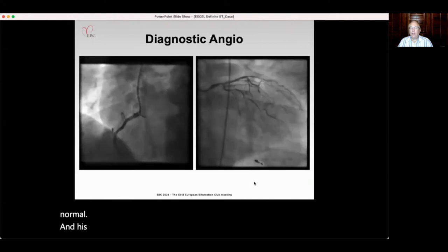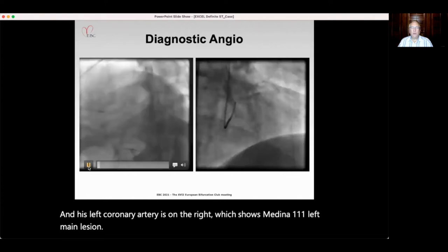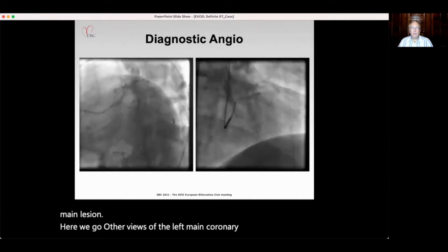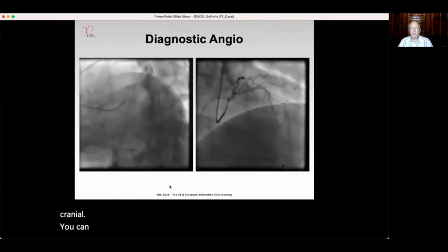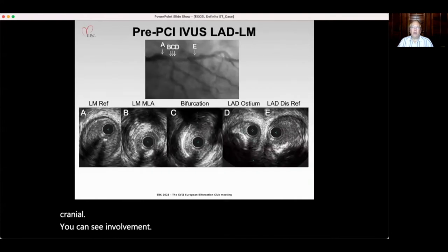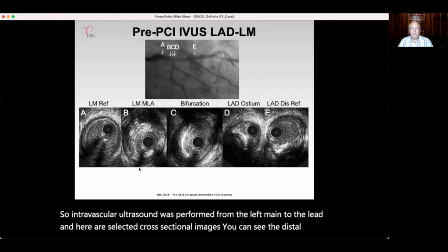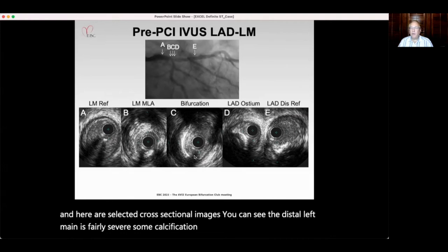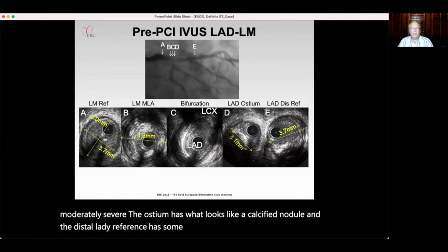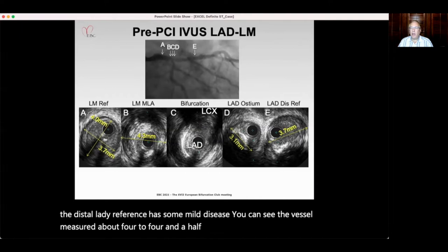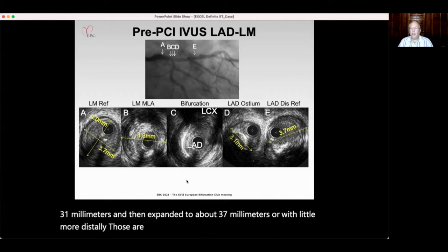His right coronary artery was pretty normal. His left coronary artery showed a Medina 1-1-1 left main lesion. Additional views of the left main coronary lesion — spider view — showing severe disease distally, in the circumflex, and LAD involvement. Intravascular ultrasound was performed from the left main to the LAD. The distal left main was fairly severe with some calcification; the bifurcation lesion also moderately severe. The LAD ostium had what looked like a calcified nodule. The vessel measured about 4 to 4.5 millimeters throughout the left main. The LAD ostium was about 3.1 mm, expanding to about 3.7 mm more distally.